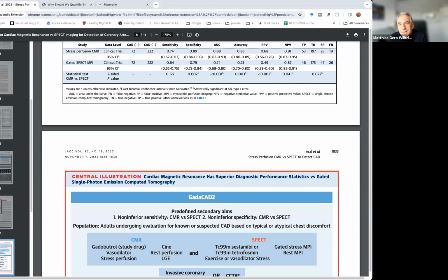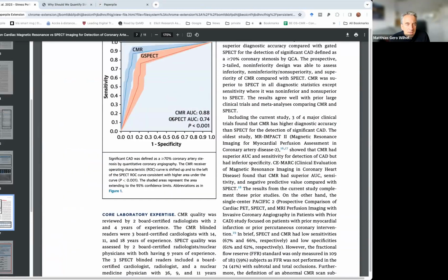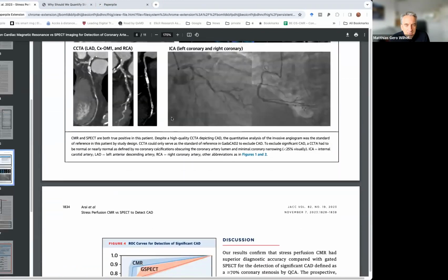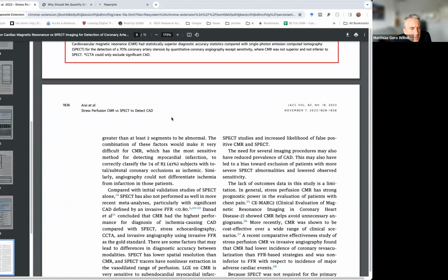And then also from Rebecca, there was a composite assessment of the stress perfusion plus LGE rather than just the stress perfusion alone. Yes, both analyses were performed, and although I don't think it was specifically mentioned in the paper, I'm aware that we analyzed the scan even without the LGE, and it was still on average superior, but I have to basically bail out on that one. I cannot be 100% sure here. I will look that up and post it then.